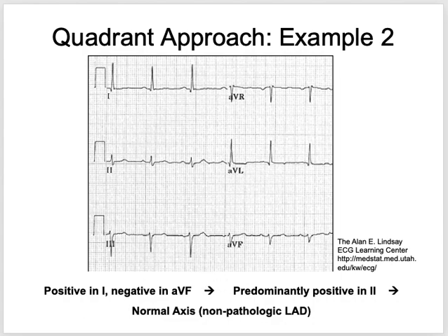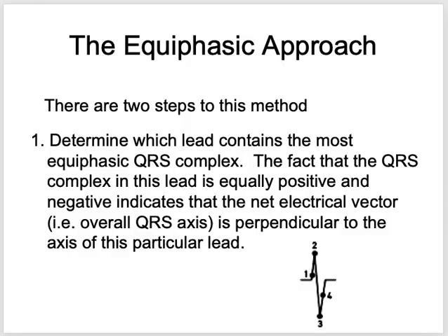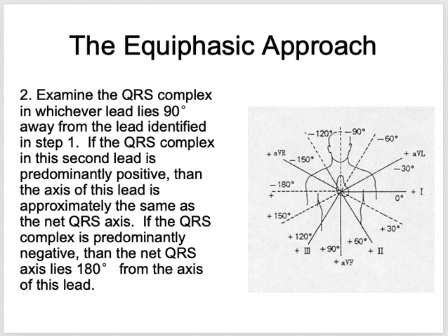So this is how we check. Equiphasic, like this one, is quite difficult, and see the same thing which I'm showing you over here, lead 1 and all the stuff, so the things will become easy for you.